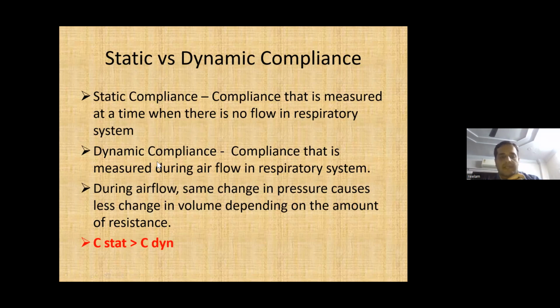Okay, so what our ventilators measure at the bedside is more of the dynamic value, because it is calculated that the gas or the flow of air always has some resistance. So some part of the pressure difference which we have created will be needed to overcome the resistance of the gas flow.